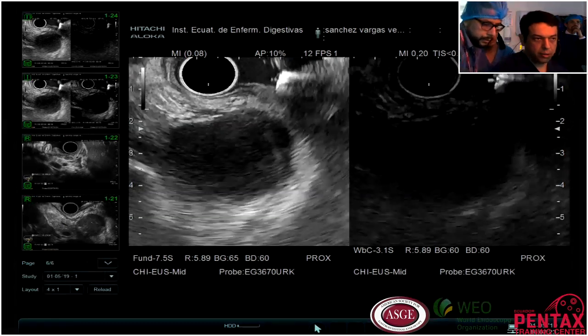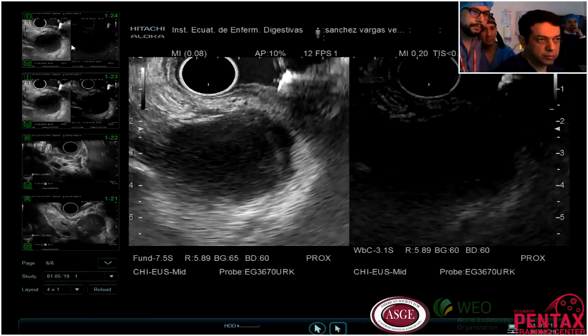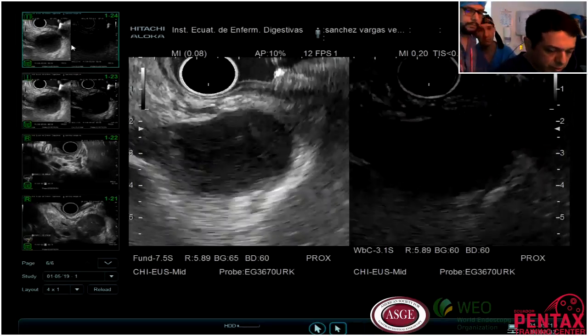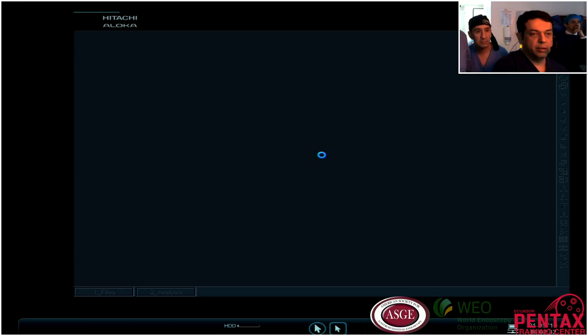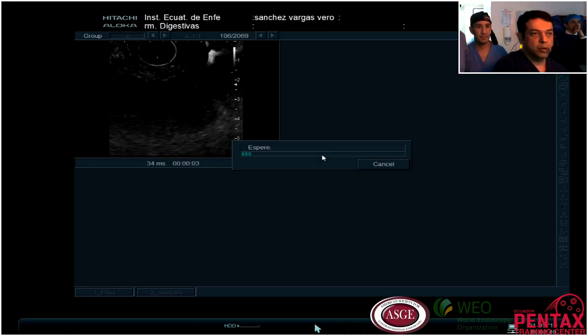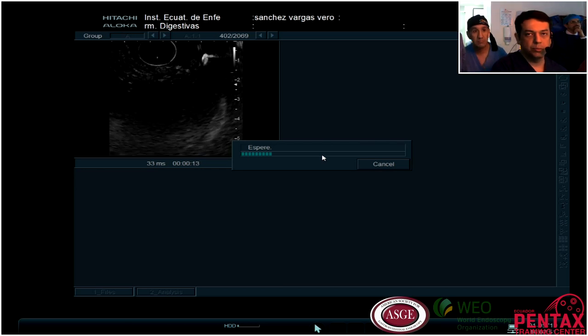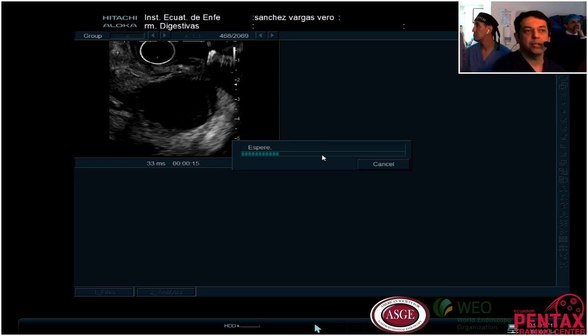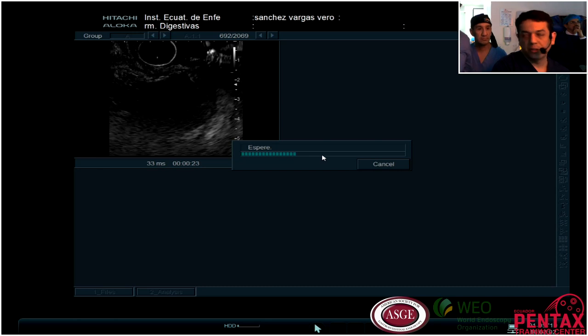So we can do an evaluation of contrast enhancement captation, but in a quantification mode, not just subjective, is more objective. So if you can see there is nothing inside, just the wall. So I believe that this probably is a pseudocyst.